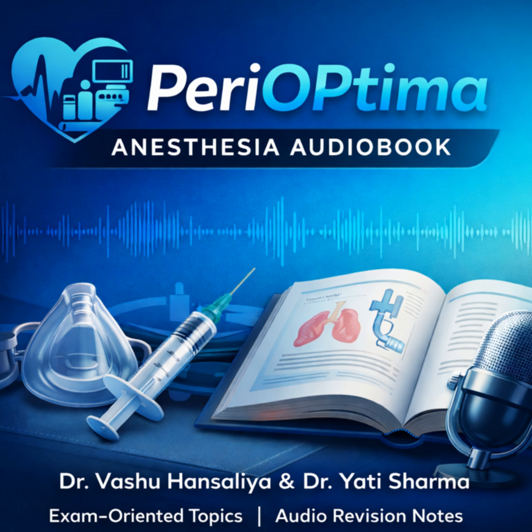Finally, what about the specialized uses that the improved safety of the second generation allows for? Right. Thanks to their improved seal in the GDC, we've successfully migrated SGAD usage into areas that were previously restricted to the ETT. This includes select laparoscopic surgeries, like a lap cholecystectomy in non-obese patients, where they can manage the increased intra-abdominal pressure without massive gastric distension.